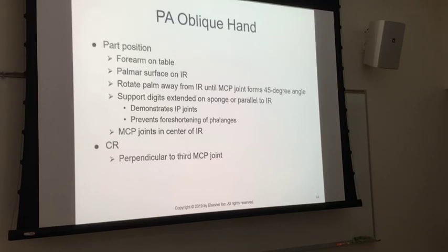Now your problem is going to be this. You're going to have a tendency, because y'all are trying so hard to get everything just perfect, right? So you got your hand right there. You say, okay, central ray needs to be right here, spot on. My collimation needs to be half an inch to an inch away from the skin level.